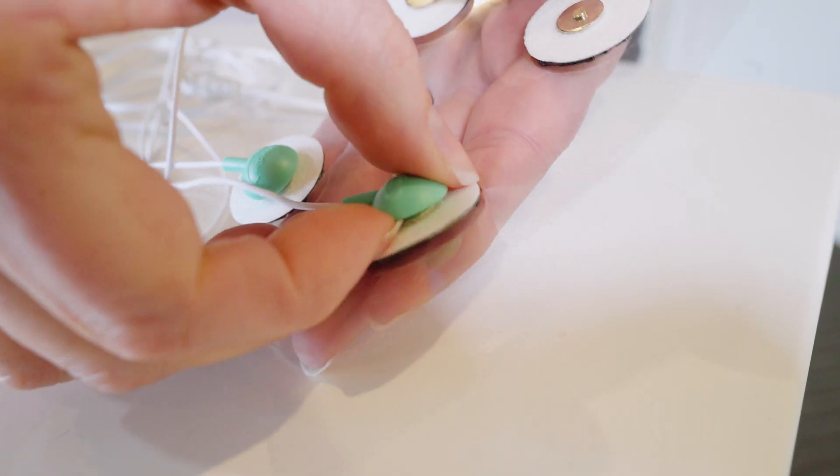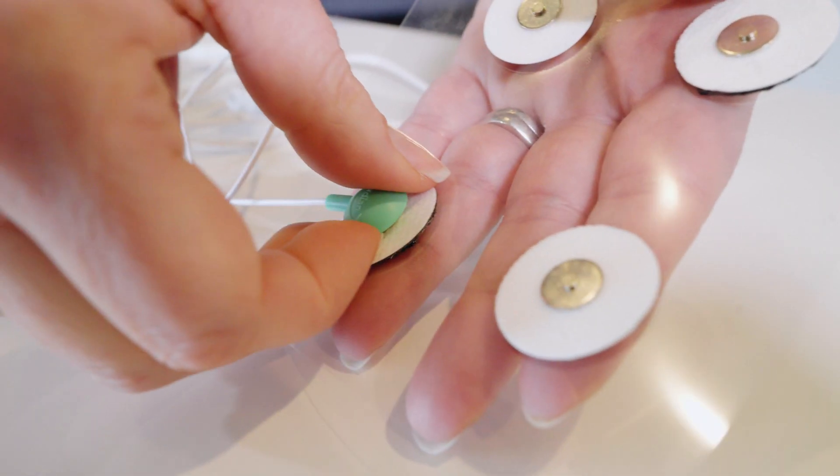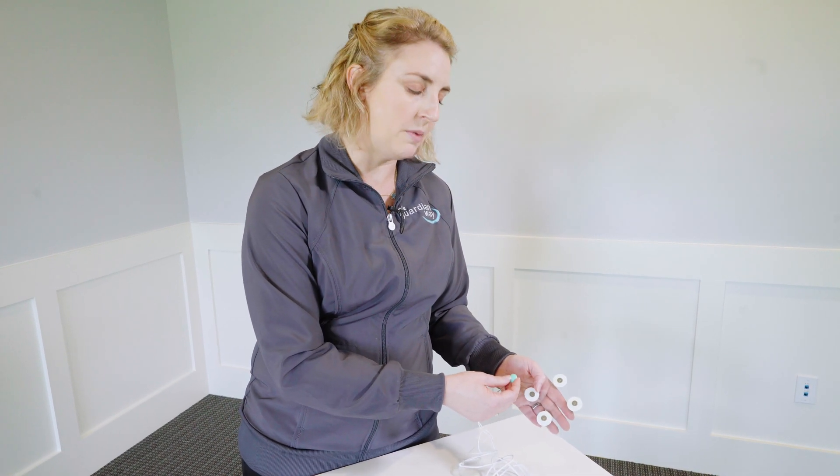When you go to remove them, you'll just pop that back off. They're a lot easier to get on and off than the traditional mini snaps.